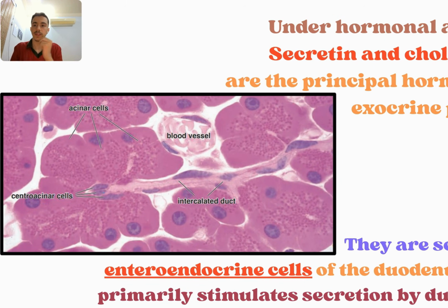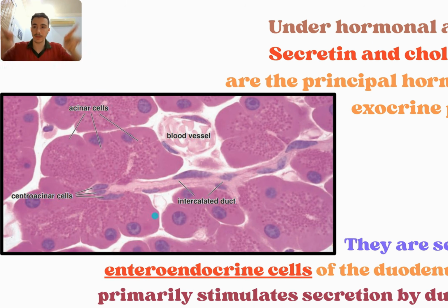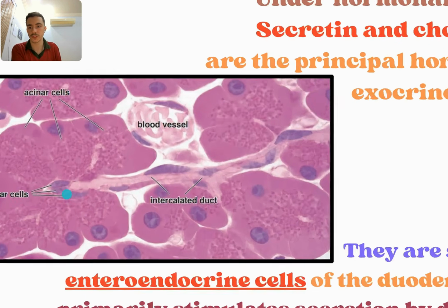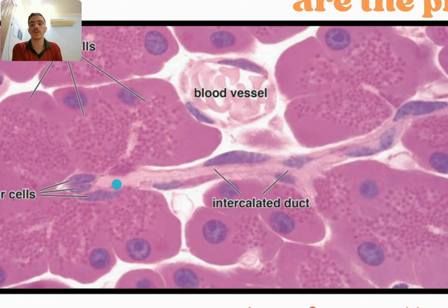Second thing, we know that in the salivary gland, in the parotid gland, the cells are peripheral, in the basement, on the outside. But as you can see here, this cell is what we call a centroacinar cell. Centroacinar cells means that there's a duct here. That's why from seeing these two cells and the nucleus here, we know that this is an intercalated duct going inside.